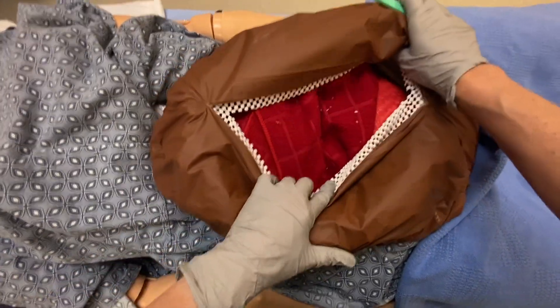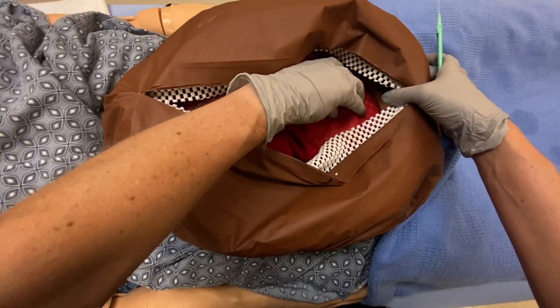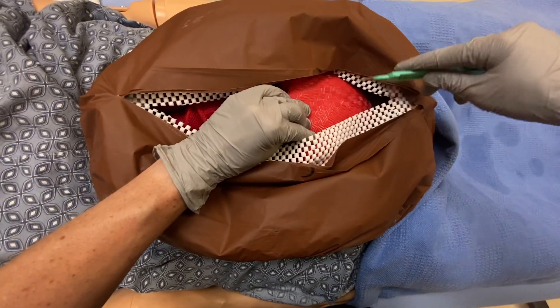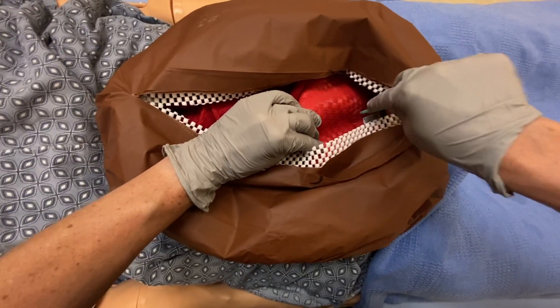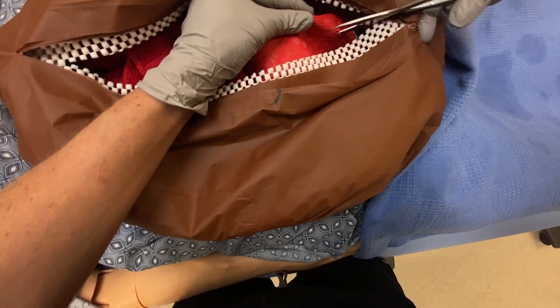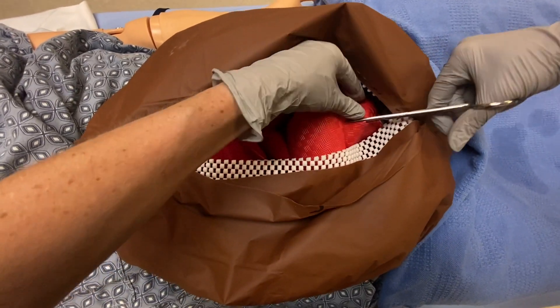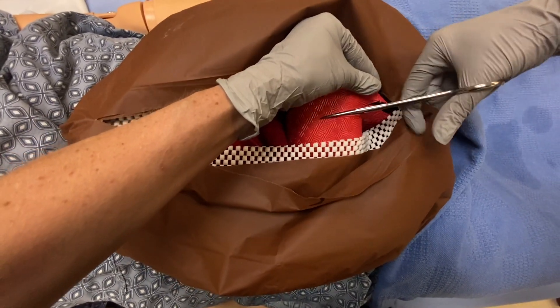You're going to have to really open up the abdomen so you can get a good view. And then you're going to lift up the uterus. You just want to make a small vertical incision on the lower portion of the uterus, and then instead of cutting with a scalpel, you're going to use scissors to cut up through the uterus to get to baby.